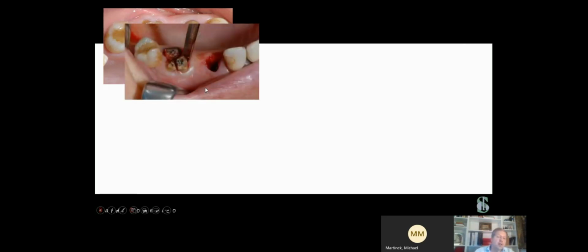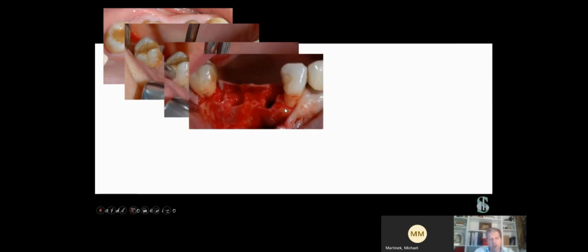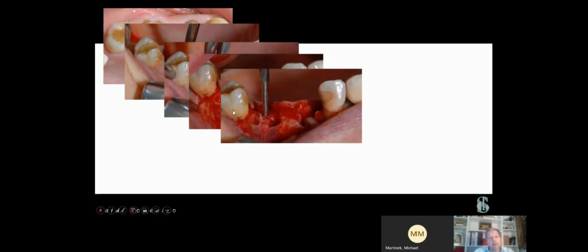Of course, if we work on a molar, we prefer to split, to separate the root, in order to make the extraction of the root in a very simple way. And again, look here at how it was possible to make the extraction maintaining this thin wall of cortical bone. And the question is, do you think it could be possible to do the same thing with another instrument? And the answer is very simple: no.